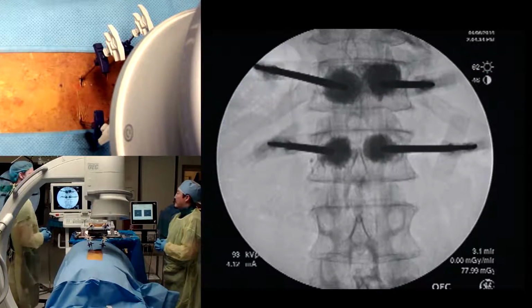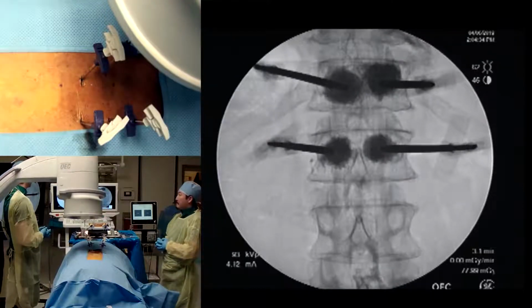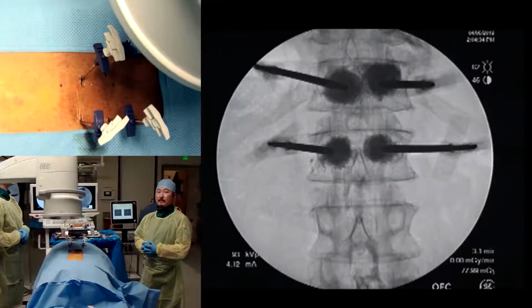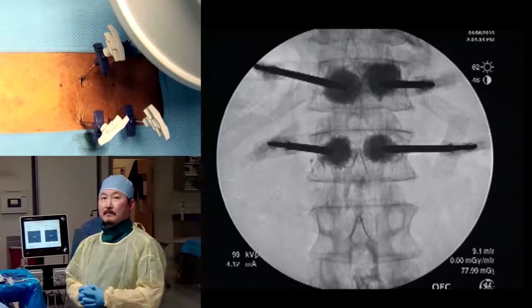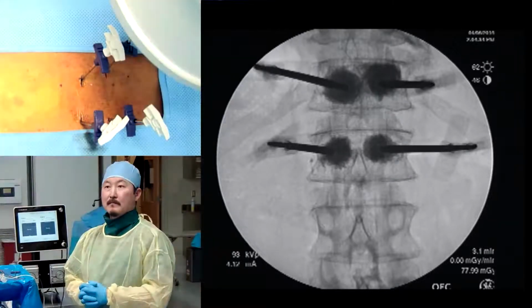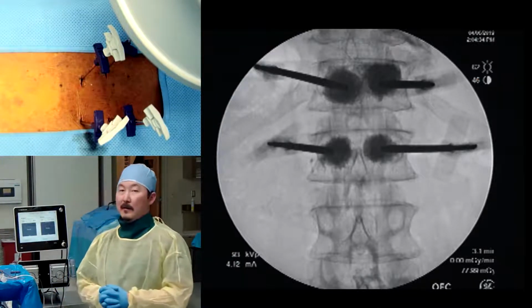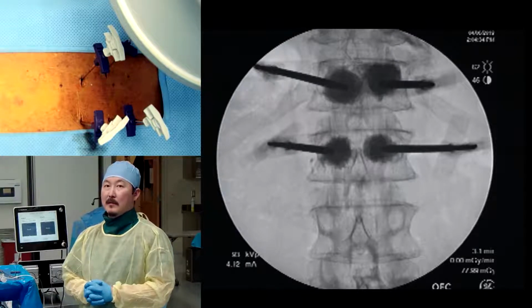Any questions or comments from the audience? Dan, any question? Yeah, I have a question. Dan Schuba here. This is straight on, perfectly orthogonal, right in the center. Do you ever angle these needles differently and try to shoot in one corner or across some fracture plane, or do you just try to get it in the middle in the zone and use the zone theory to avoid extravasation that's safer and better, or do you actually try to be directed?